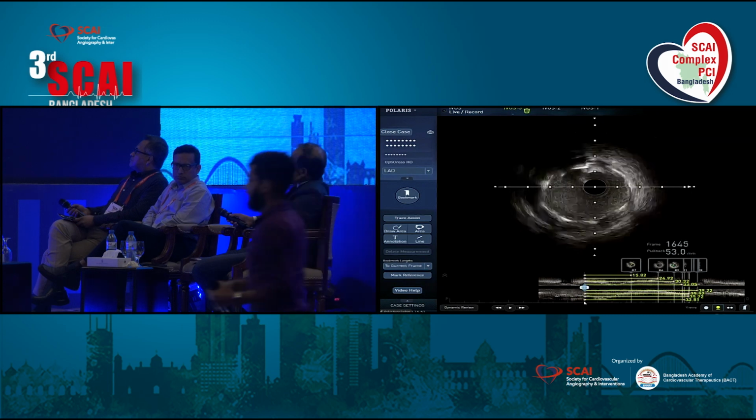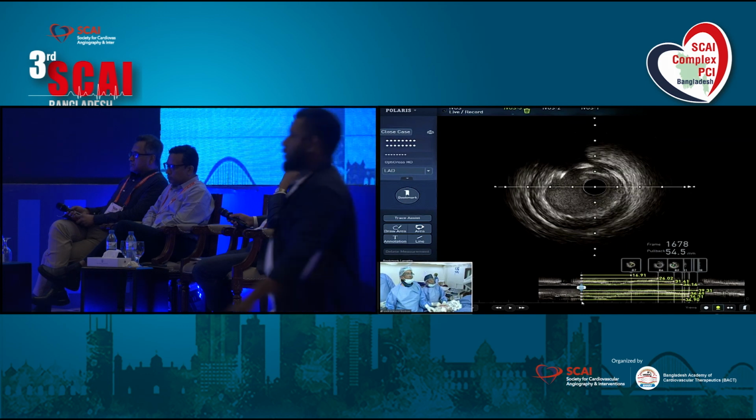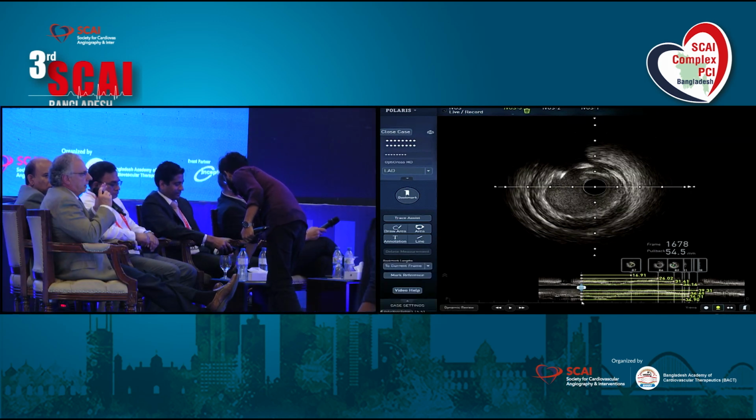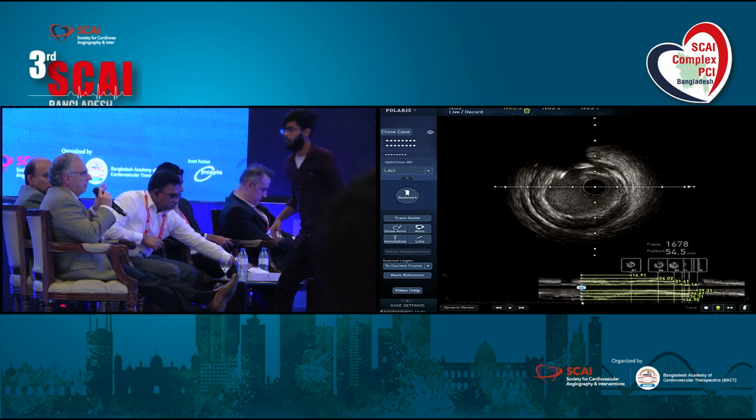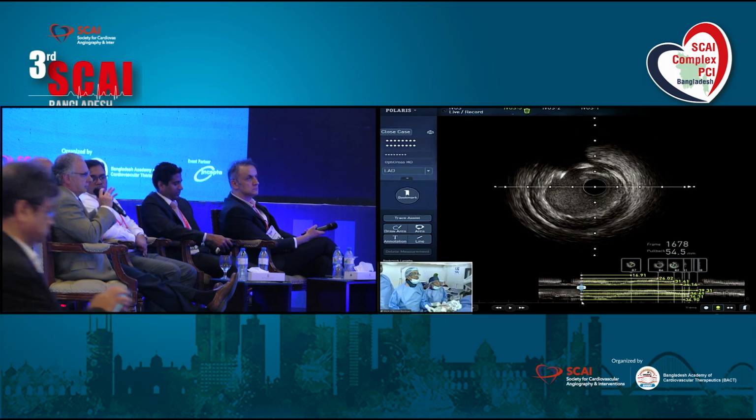So I think this is an important subject because you can either underexpand or you can overexpand and create problems. So I will give you two different measurements. Why don't we clarify for everybody, when you use IVUS, you use a distal reference site that has less than 50% cross-sectional area stenosis and a proximal that has the same criteria.